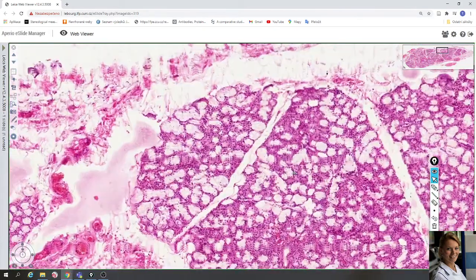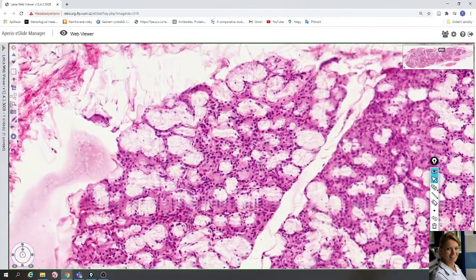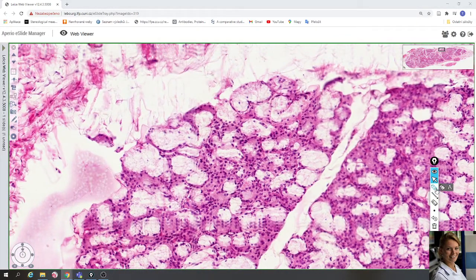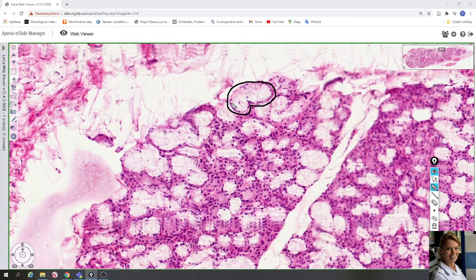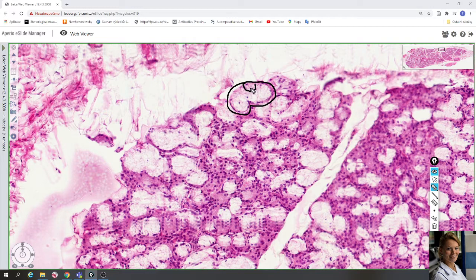Here you can see the lobe closely, and here you can see mucous cells. The mucous cells are light or pale and contain small dark nuclei in the periphery, in the basal compartment of the cells. Their cytoplasm contains mucous vacuoles and is very light.